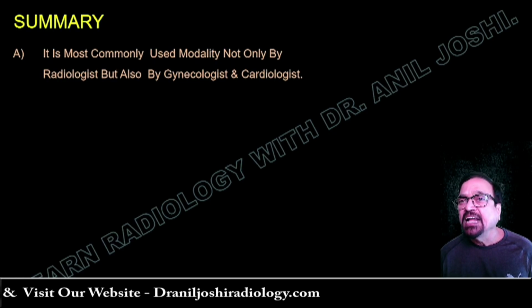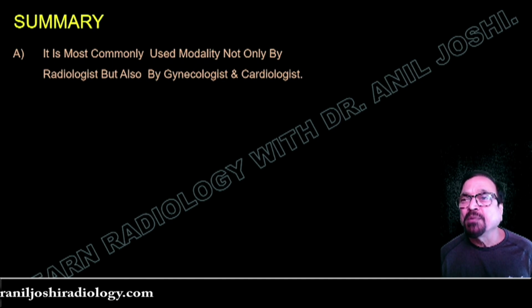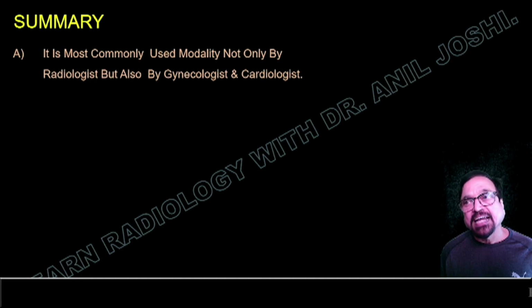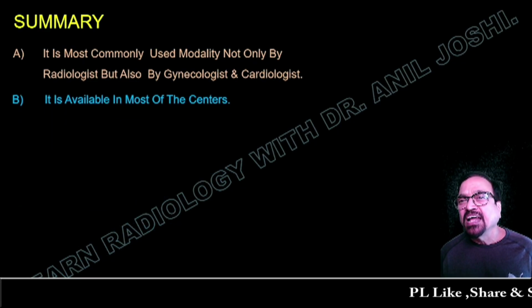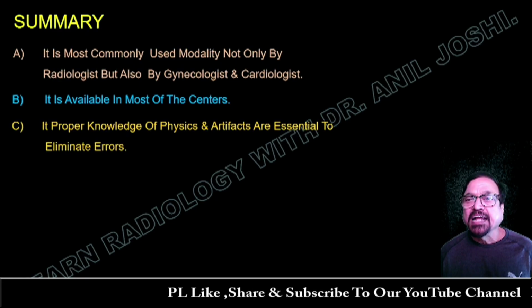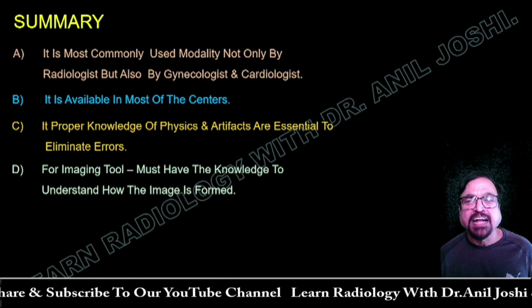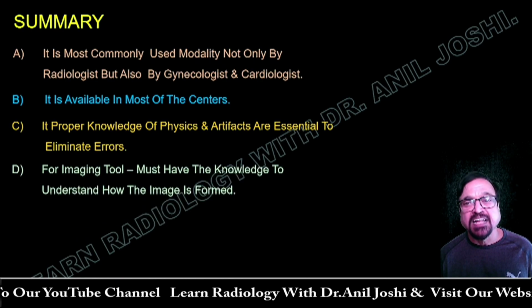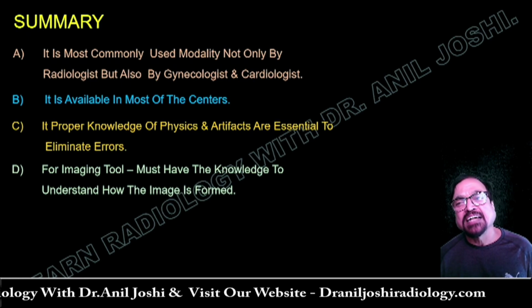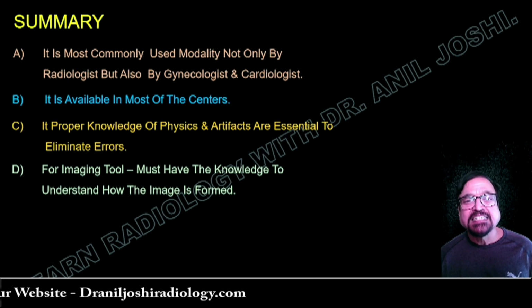Now, in summary, ultrasound is the most commonly used modality, not only by the radiologist, but also by the gynecologist and cardiologist. It is available in most centers. Proper knowledge of physics and artifacts is essential to eliminate the artifacts which can otherwise cause a serious error. For an imaging tool, you must have an understanding of the image, how it is formed. Why we teach basic physics is this reason.